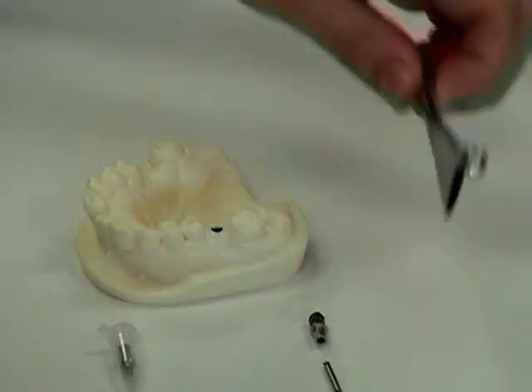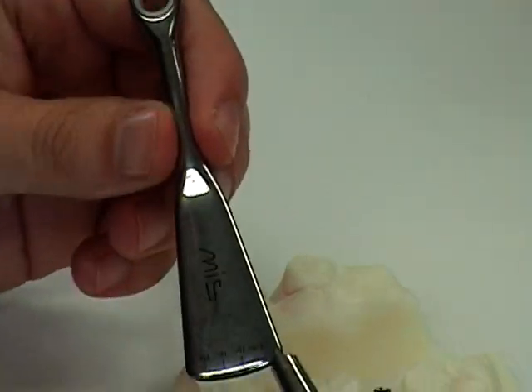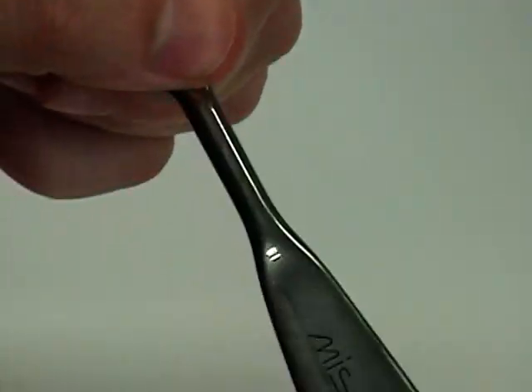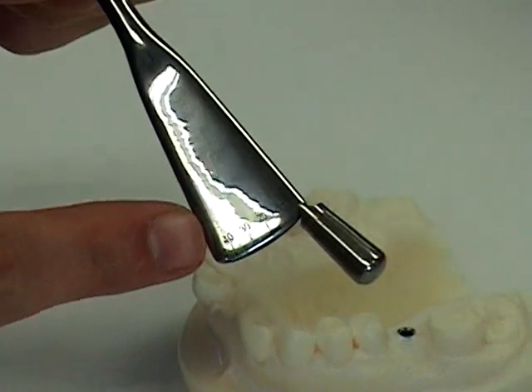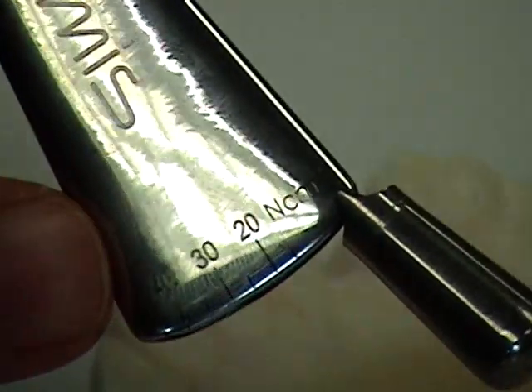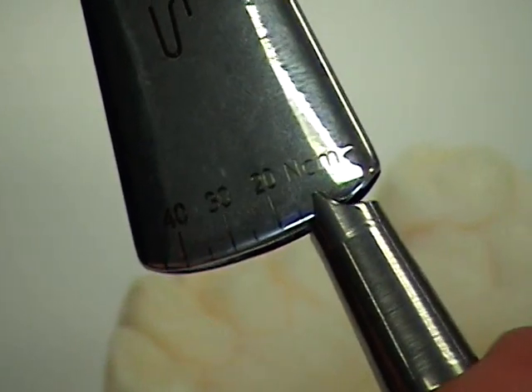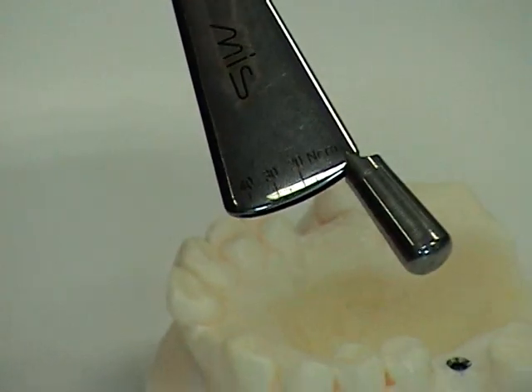When you're torquing in an abutment, it's always recommended to use a torque device. In this case, we'll use the MIS torque wrench. The benefit here is that it is an actual wrench with ratchet action. You can also, if you look closely, see that you can check the measurements of the torque as you're inserting it — the outer handle will move to point at the various torque readings in newton centimeters.